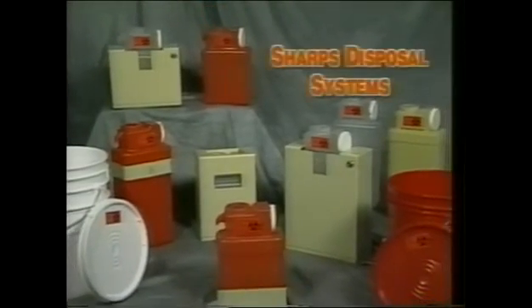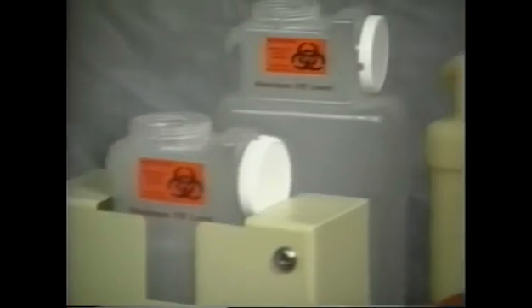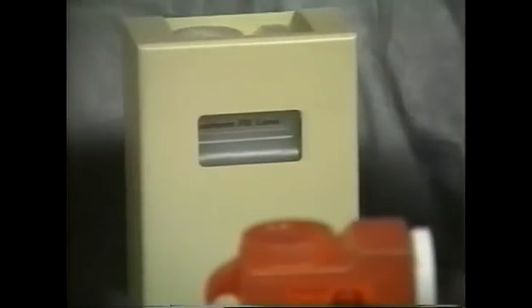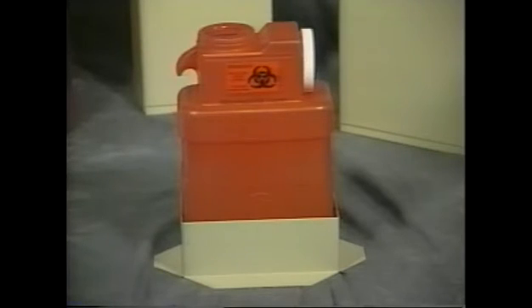We are also pleased to offer a complete line of sharps disposal systems for safe disposal of infectious waste. Our systems feature containers that are totally leak-tight when sealed — not only the sides and bottom, but the entire container. OSHA requires that filled sharps containers not be allowed to leak during handling, storage, transport, or shipping. Our newest feature, a locking cap, will increase safety for everyone handling the filled containers, helping ensure fluids and contents remain inside the unit. Our plastic containers can be housed in puncture-proof metal cabinets or used with a metal stand. The metal cabinets incorporate a view window that allows personnel to view the level of contents before dangerous overfilling occurs. The metal stand, generally used in non-patient areas, keeps the plastic inserts upright and ready for use.